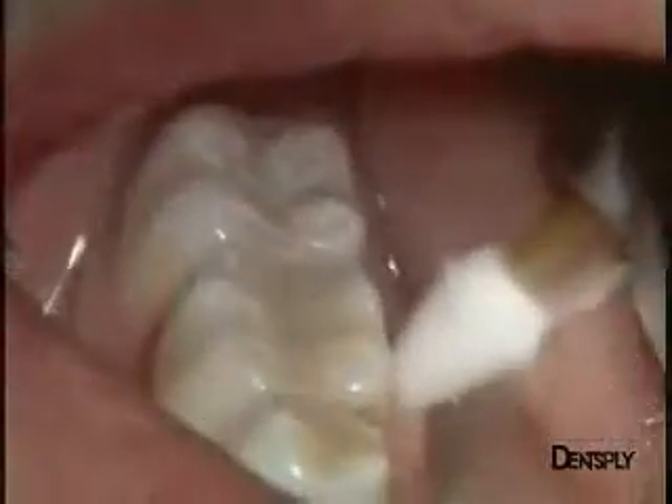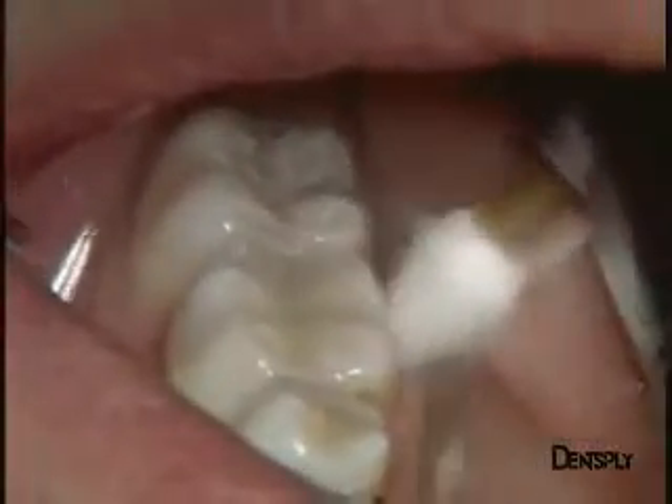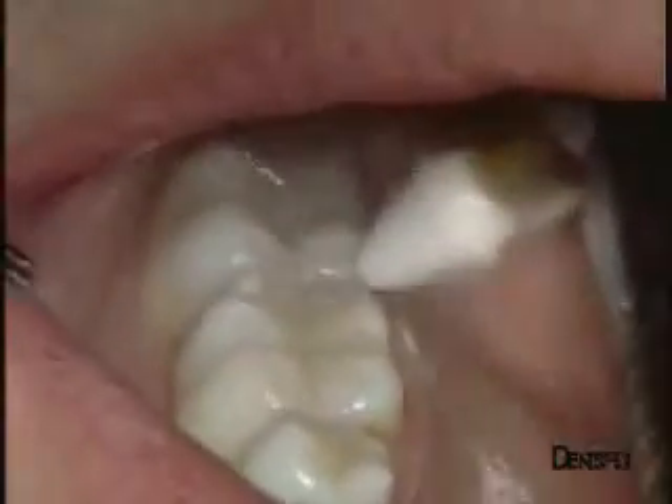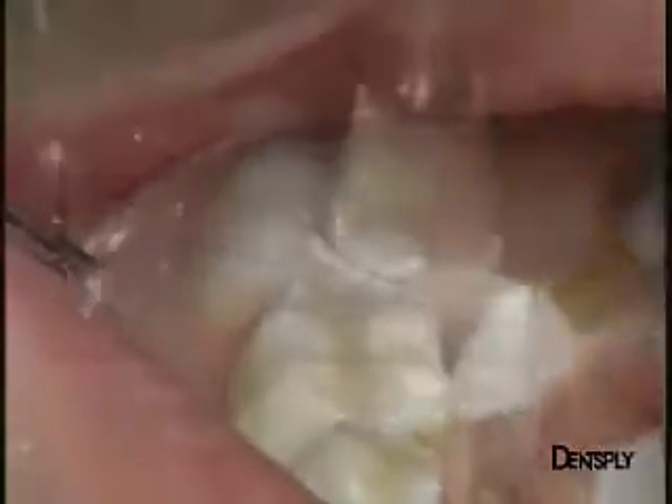Polishing of the restoration surface at this stage is done with an Enhance point. Shining is carried out using again the Enhance system with the Enhance cup and the Prisma Gloss polishing pastes. Two grit sizes — regular and extra fine — are available in order to obtain a perfect surface luster.